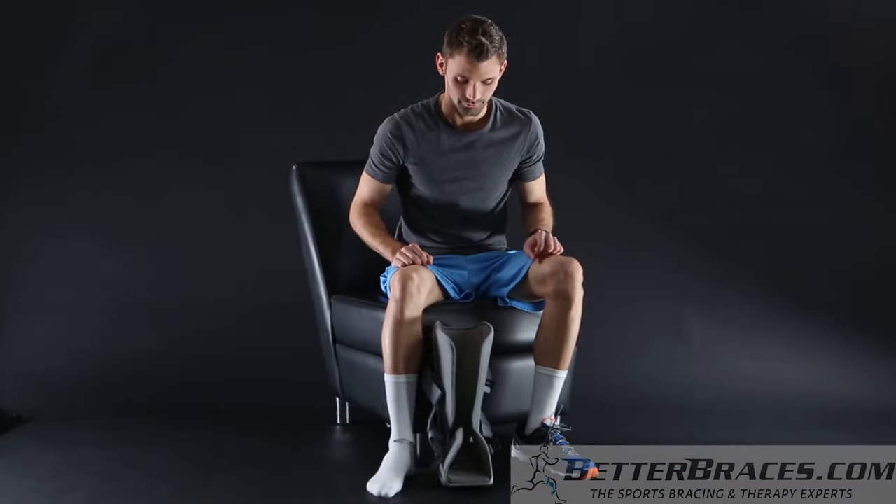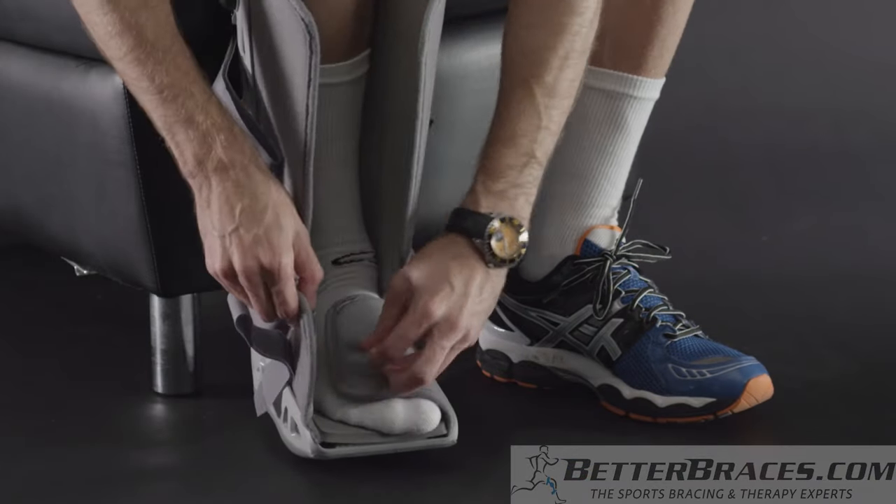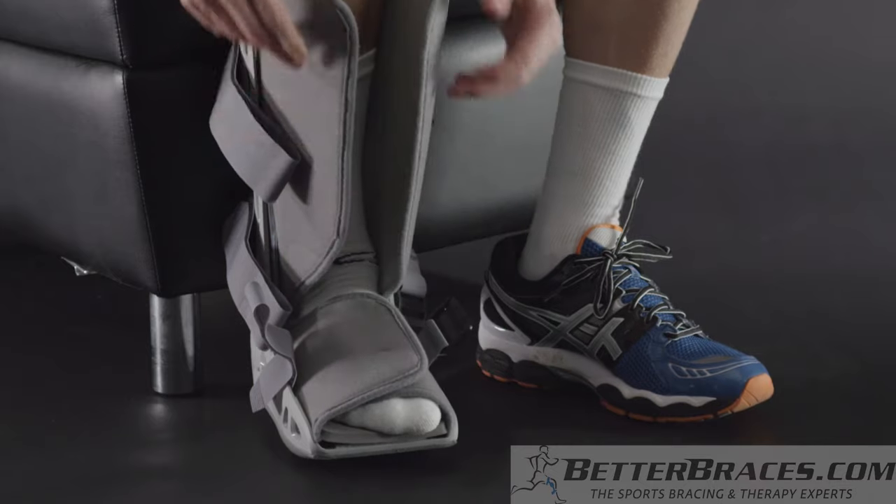Sit in a comfortable position. Place your foot in the boot with your heel against the back of the boot. Wrap the liner around your foot, then your leg.